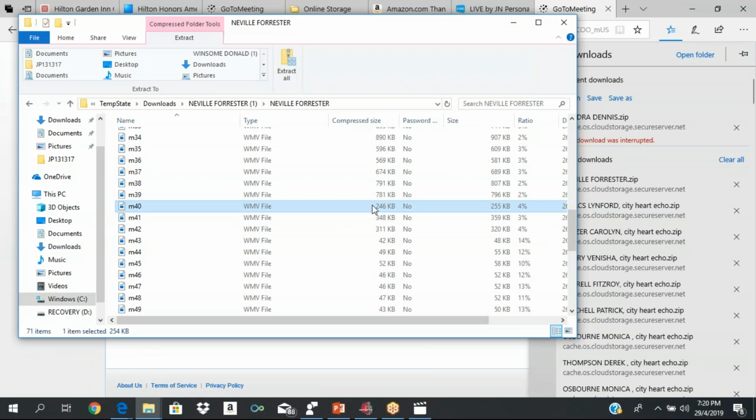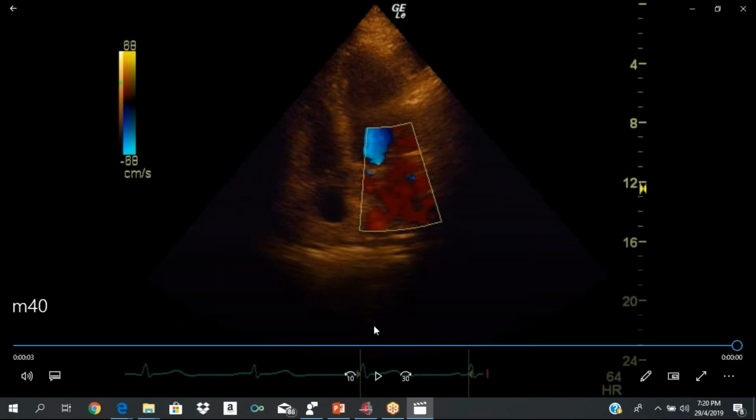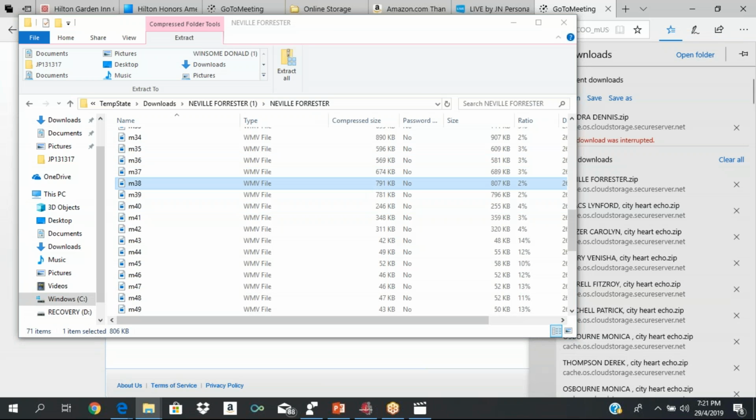So again, remember, it's practice, practice, practice. Okay, so the 4-chamber view. You're going to locate the apex of the heart, at the mid-clavicular line and the 5th intercostal space, and your marker is pointed towards the 4 or 5 o'clock position, and you get your 4-chamber view.